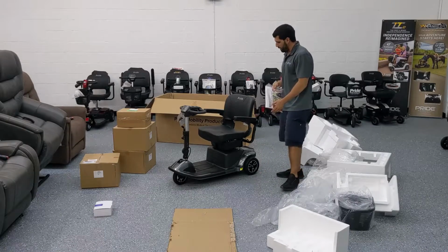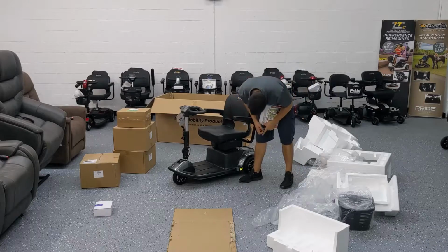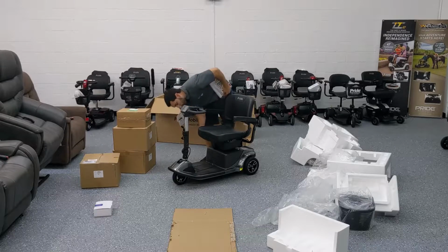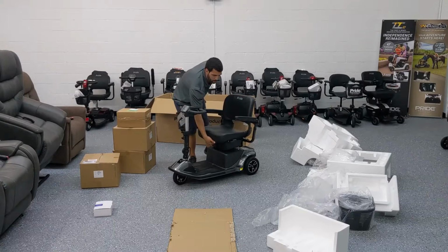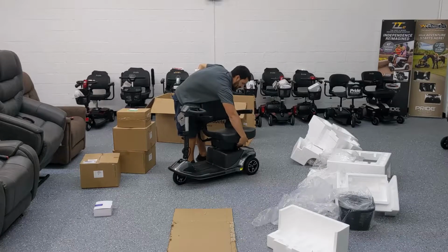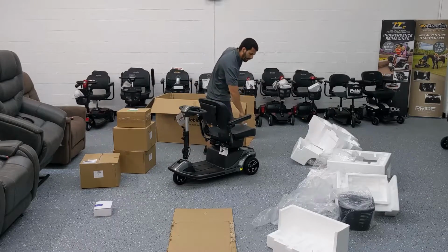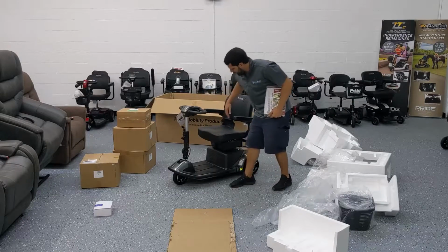All right, now that we've got the armrests on, I just want to show you that they do flip up. The chair rotates. There's a lever here. You lift the lever slightly and start rotating. It's right in between the two cubby holes, and it rotates. It locks into place in 8 different spots. So spin it until it locks, and then it's stuck in that position until you unlock it and spin it into the next desired location.